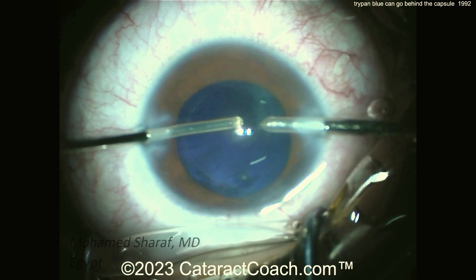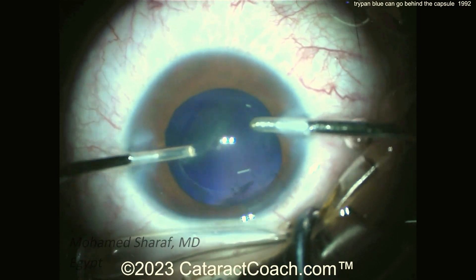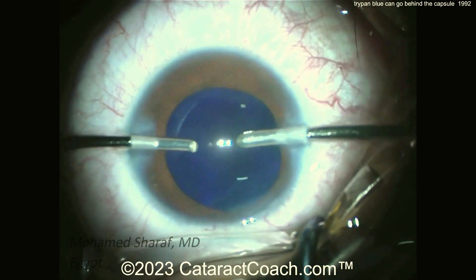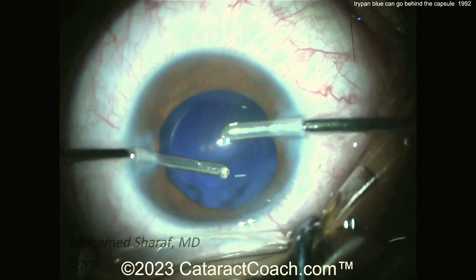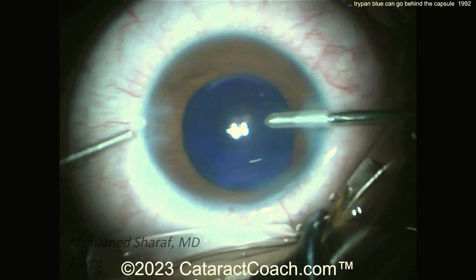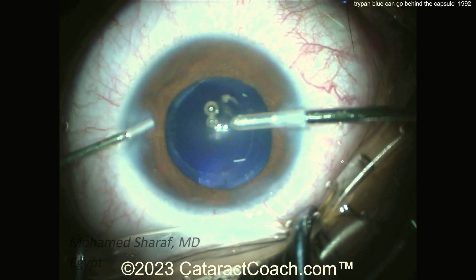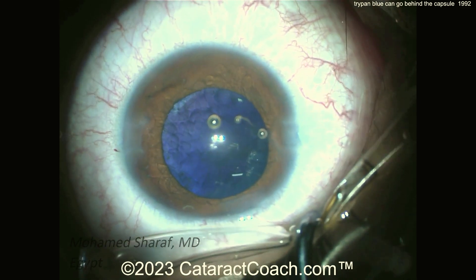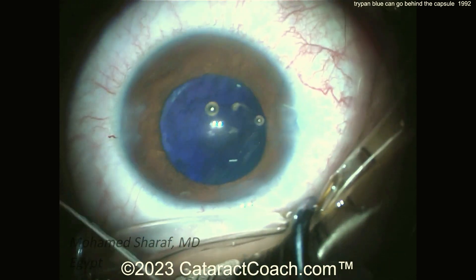Do you have to do anything for this? You don't. Just finish up the case — the blue dye is going to go away in a couple of days. The patient will be just fine, so you don't have to worry about it. Get the lens in the bag and complete things. The tough part is, as a surgeon, you have less of a view, so it's a little more challenging. There's the viscoelastic — again, a blue reflex, not a red reflex.